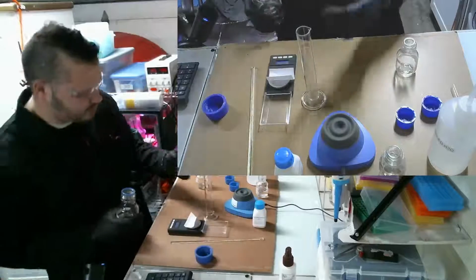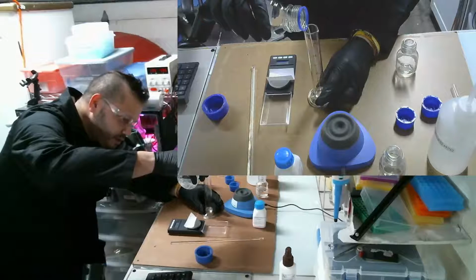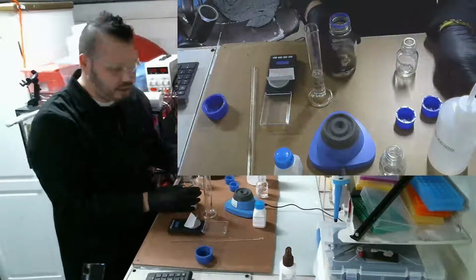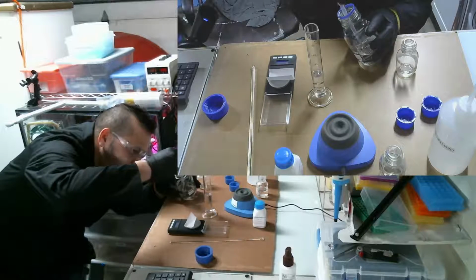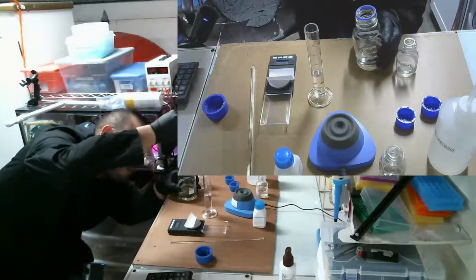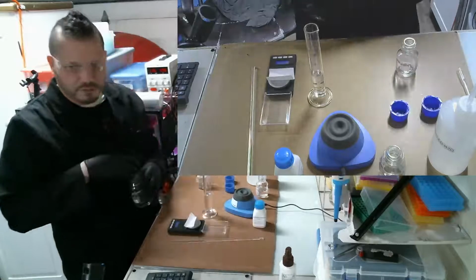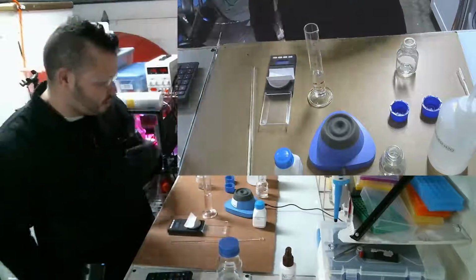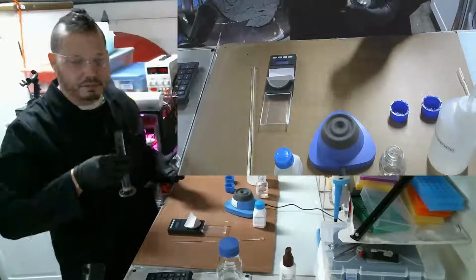The studies were done over the span of a month, and I want to see what the effects are on the spirulina if the inoculation of hormones occurred over a 3-month period, essentially giving it enough time for many generations of spirulina to grow. And the idea is to see if there are any negative effects on the spirulina themselves. It could be anything. Perhaps they become resistant to the hormone. That could be a possibility.